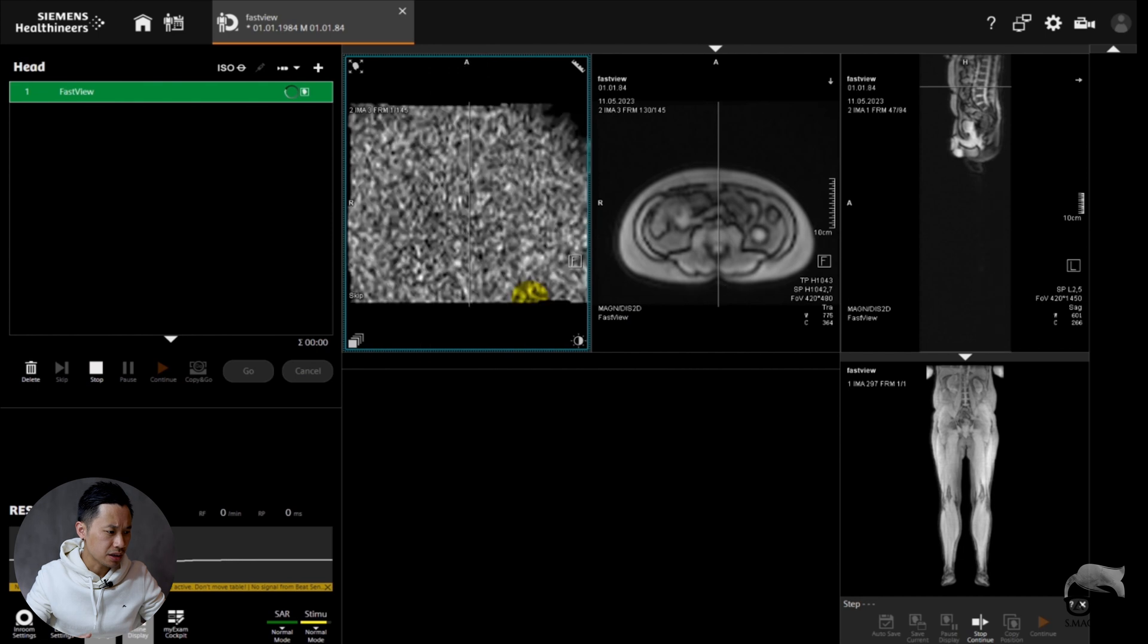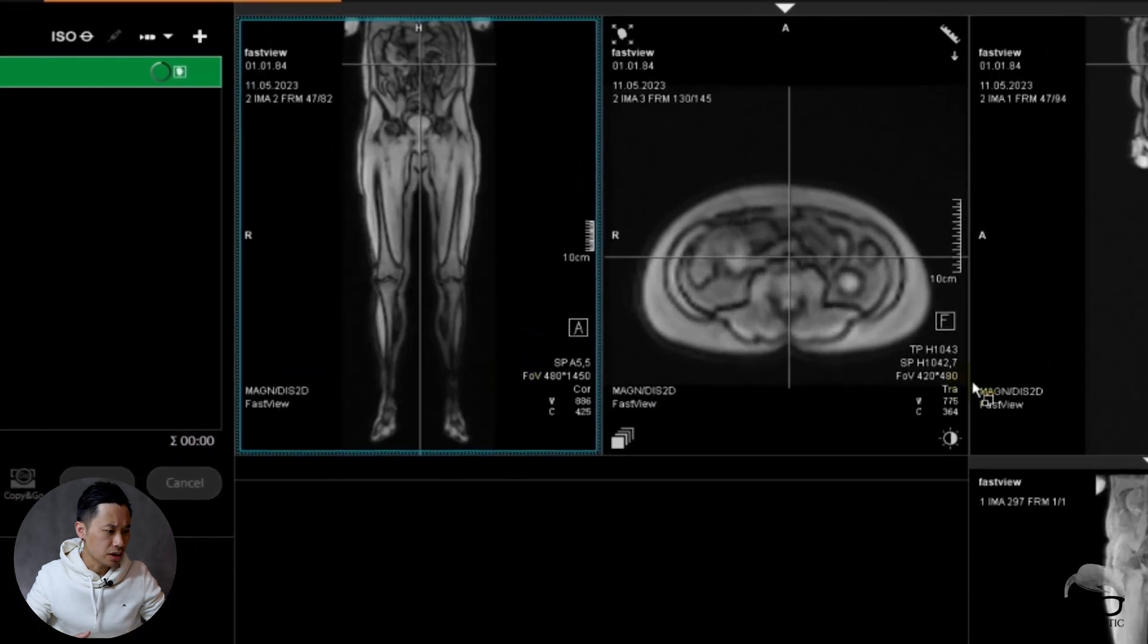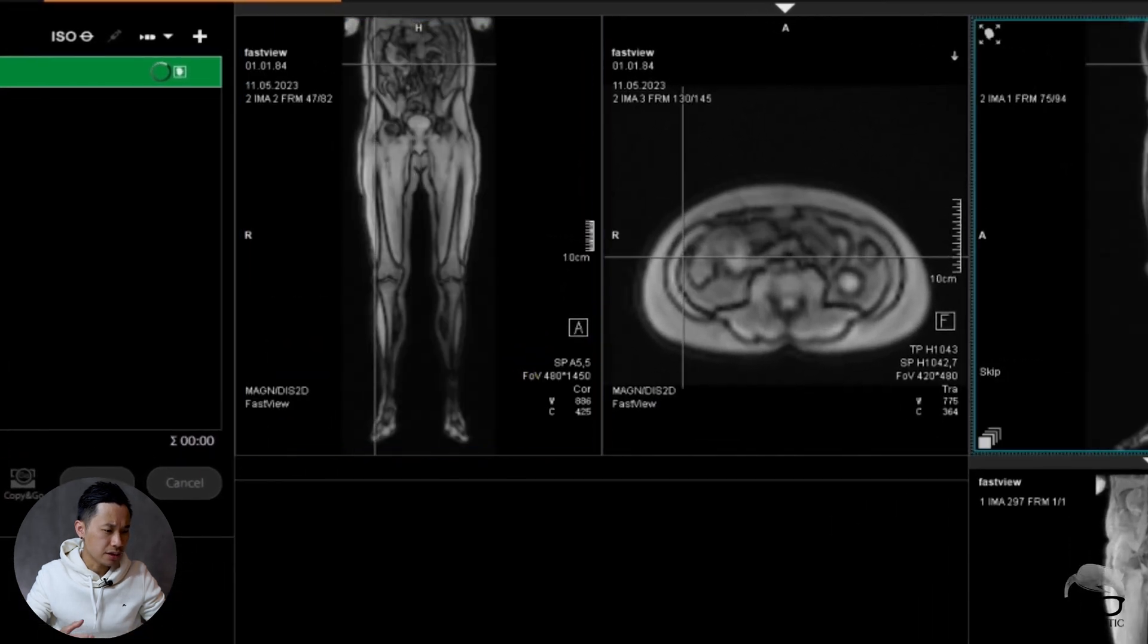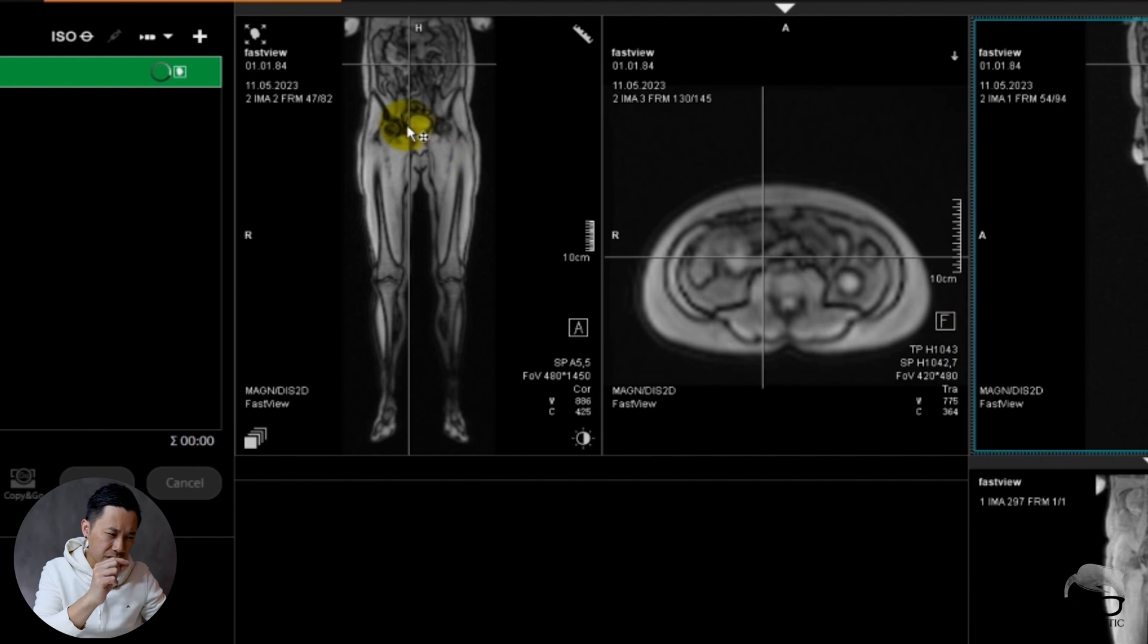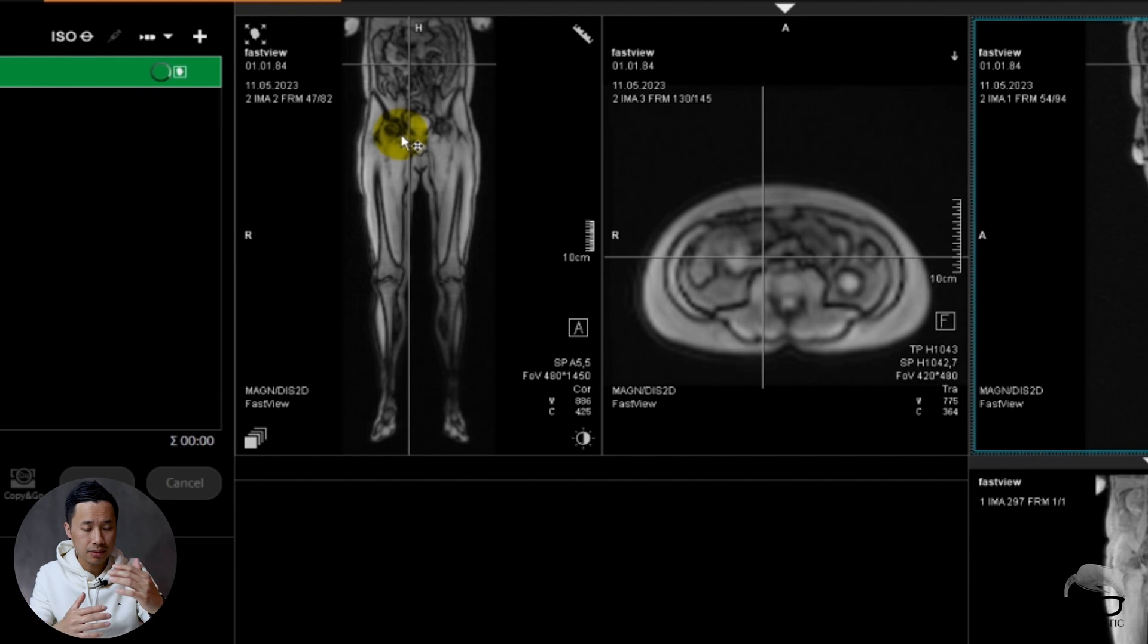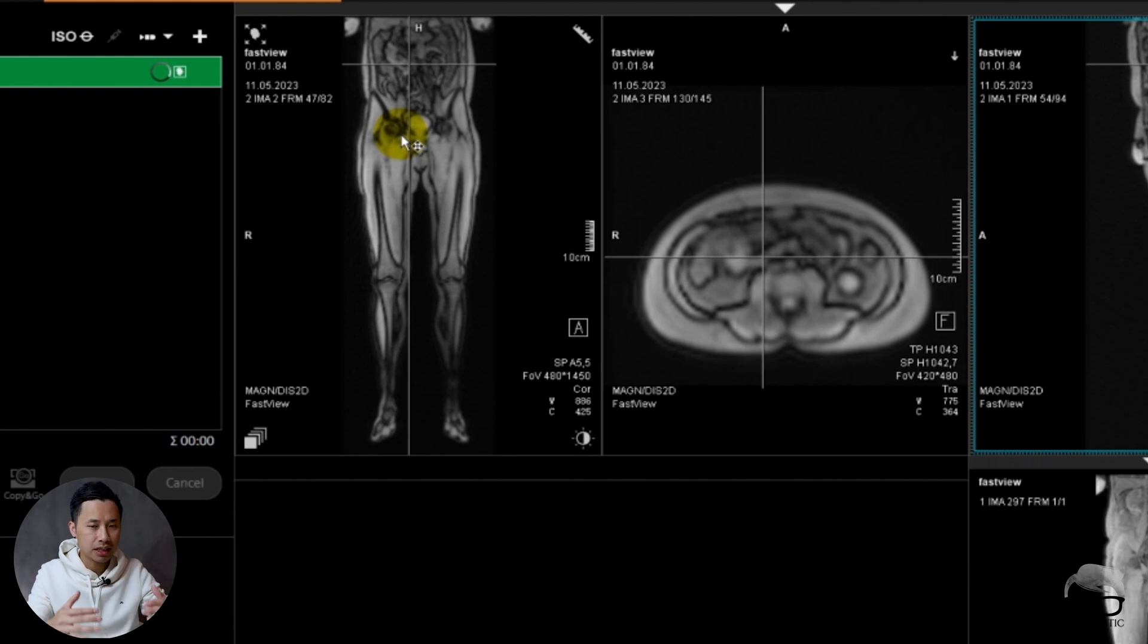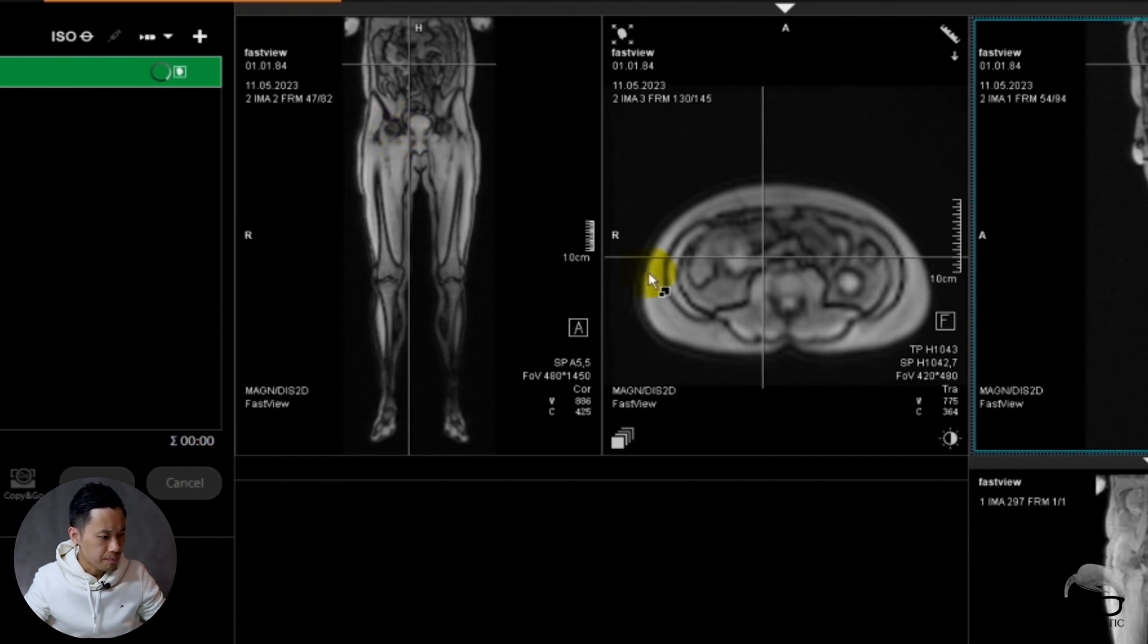Sometimes if you create your own localizer and your interest is a specific region, like at the hip, you don't have transversal plane slices which cover that specific area. But with this localizer, you have it from top to bottom, so it's already time savings right there.